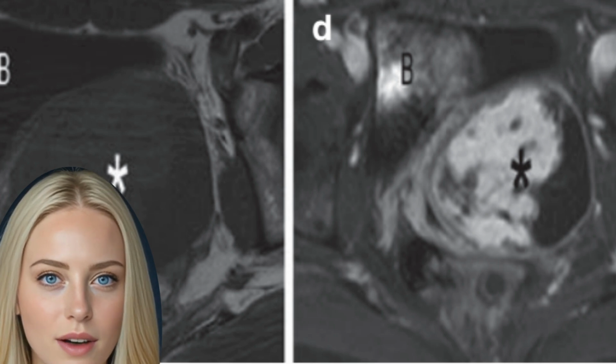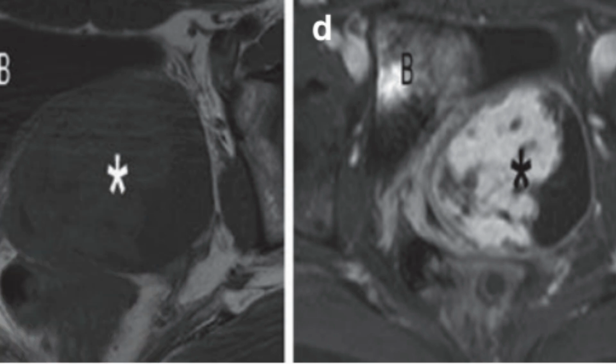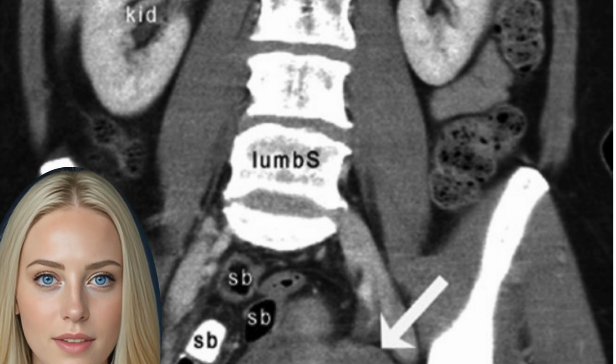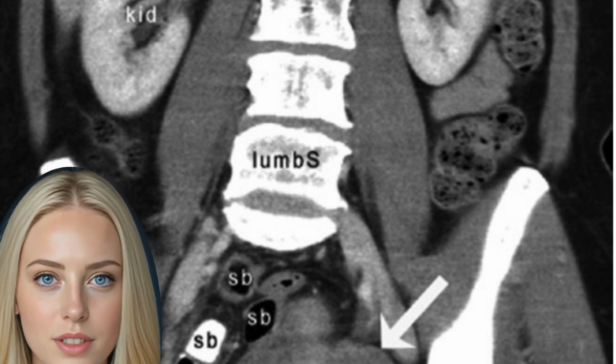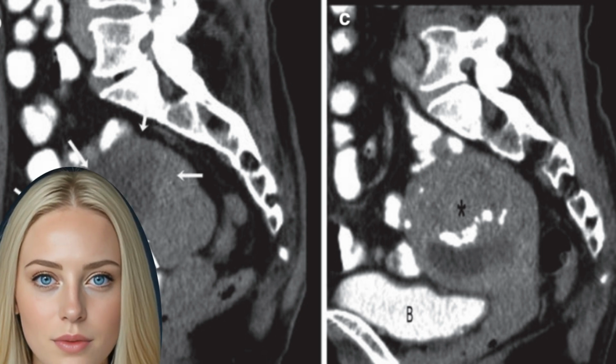Uterine sarcoma can be classified into three histological subtypes: leiomyosarcoma, commonly myometrial origin, endometrial stromal sarcoma, and adenosarcoma, commonly endometrial origin. The transvaginal ultrasound is used as the primary standard image modality. In addition to this, MRI offers relevant additional information about tumor expansion. The CECT provides an overview of the infiltrated surrounding structures, distant metastases, ascites or peritoneal implants.